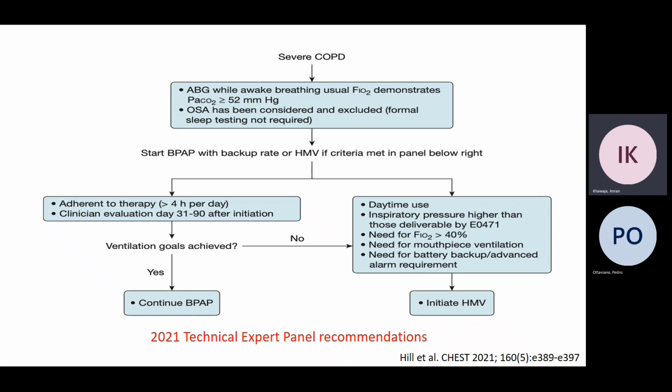If someone comes with COPD flare-up in the hospital and he stayed for 24 hours until he gets intubated and no one tried the BiPAP, that's a lawsuit, because it's level 1 evidence. But you have someone with COPD, CO2 of 60s, okay, they can wait until we see them in the clinic. Even if it's bad, even if this patient got intubated. So it's a conditional recommendation. It's not like a high level or a quality improvement parameter. So you have to understand what the difference is. Okay, any questions?